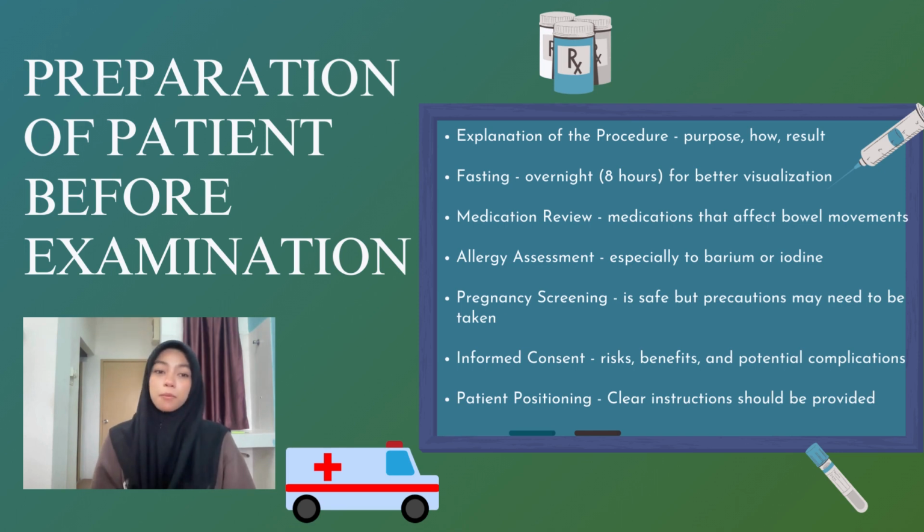Most important is informed consent. We have to make sure that the patient acknowledges the risk, the benefit, and the potential complications that we could get from this procedure. Last but not least is patient positioning. We as radiographers should provide clear instruction for the patient.